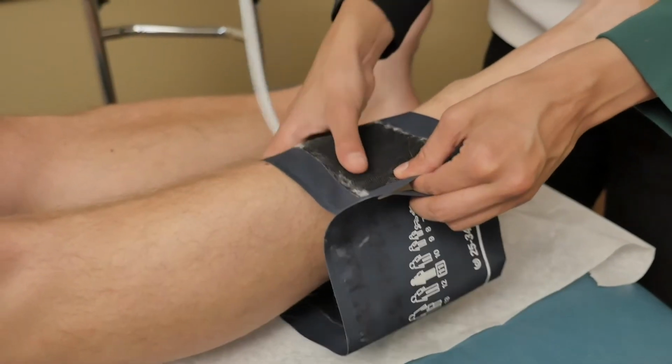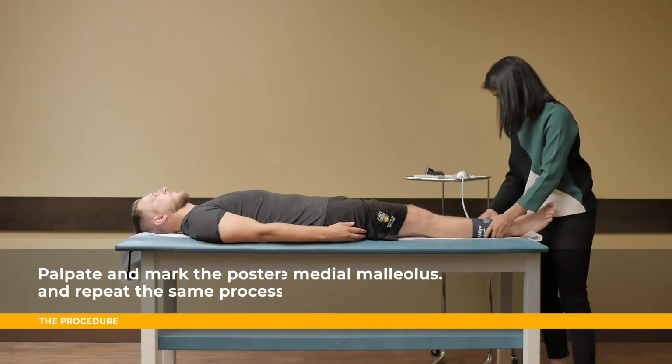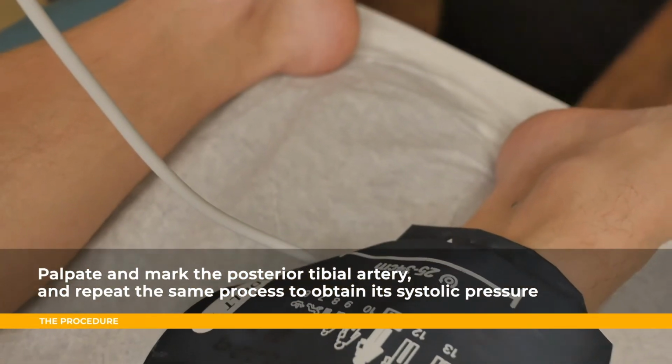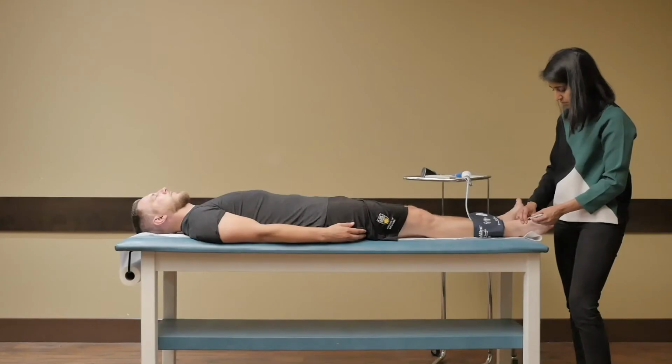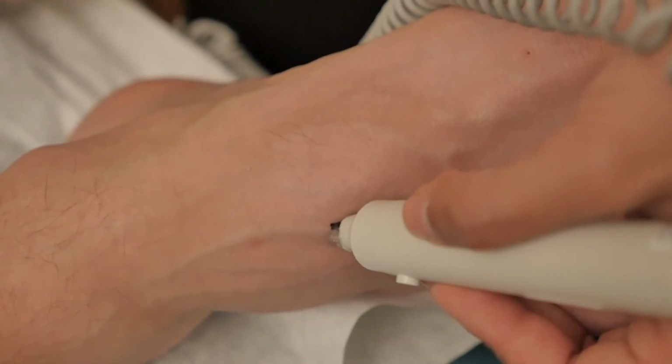Next, move to the right leg. Apply the cuff 2 centimeters above the medial malleolus. Palpate and mark the posterior tibial artery and repeat the same process to obtain its systolic pressure. Repeat this process for the dorsalis pedis artery and record its pressure separately. To complete the procedure, repeat the same Doppler assessment for the left leg and arm.